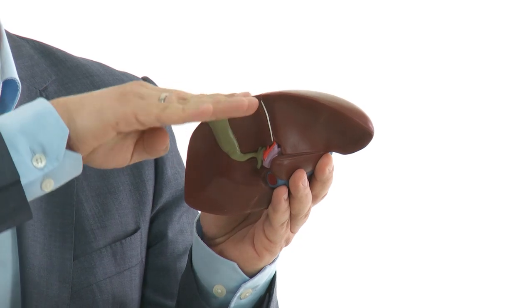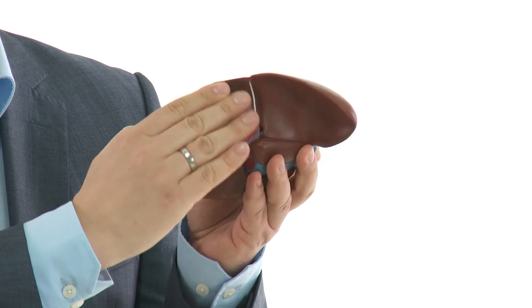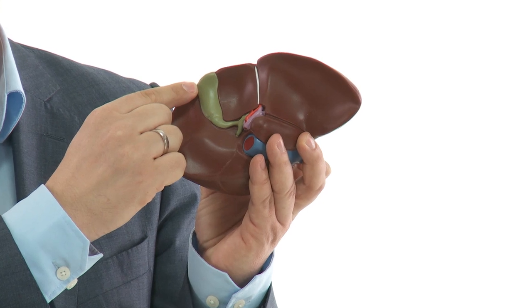Scan the center of the liver in a subcostal view, which means you place the probe slightly inferior to the costal margin and press it against the ribs and angle the ultrasound beam under the costal arch. When you tilt the transducer upwards and downwards, you will find the porta hepatis and, in this region, the gallbladder. Let's see this on a patient.